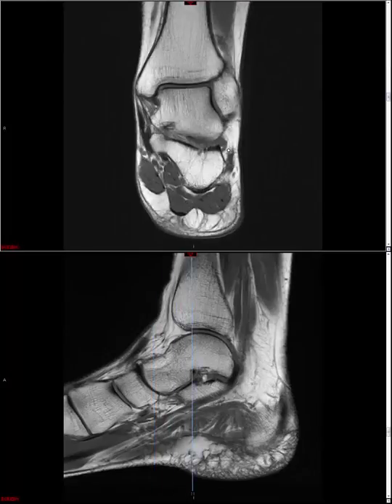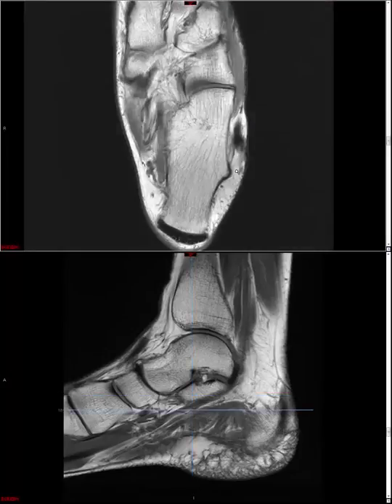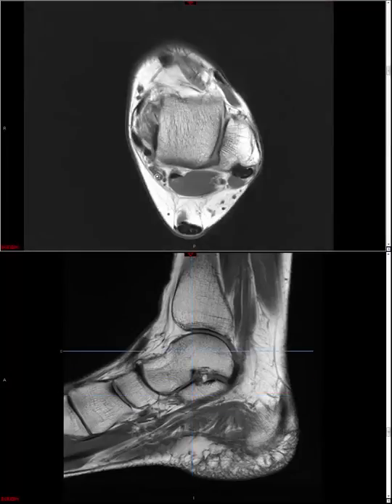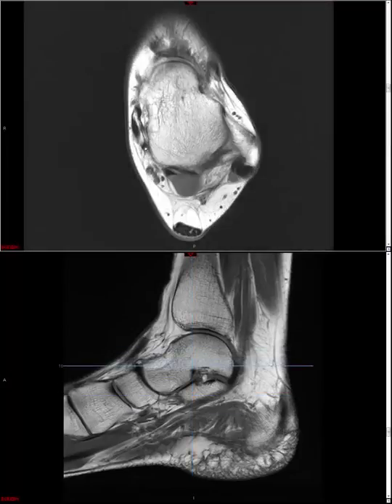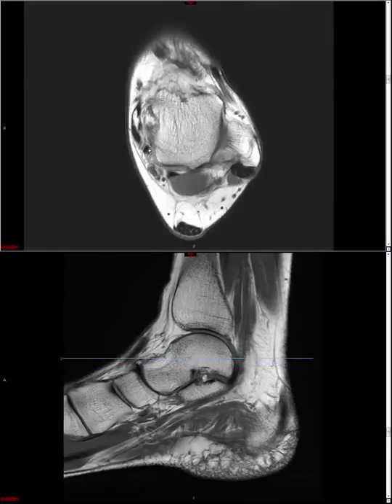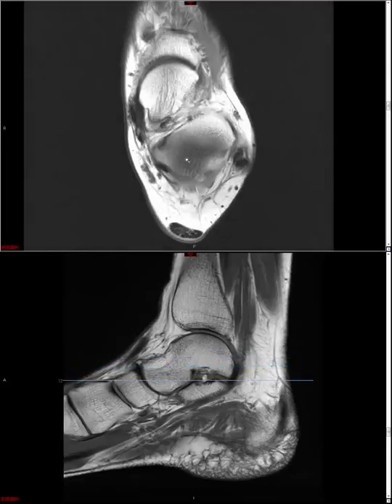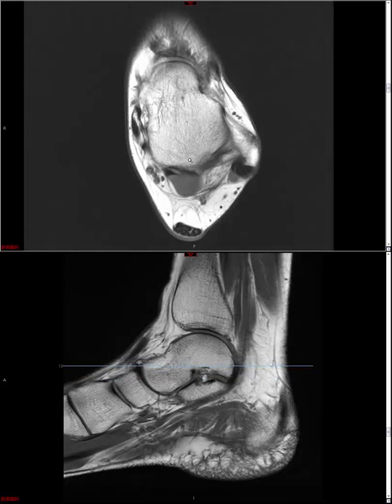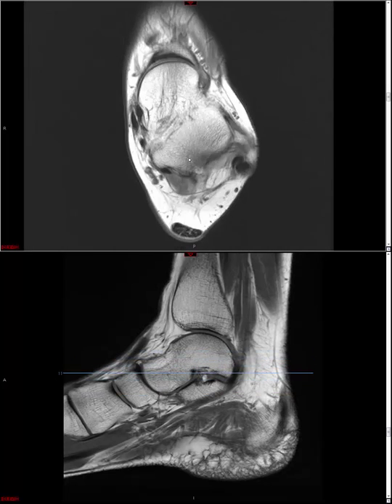On a more distal image, here is the sustentaculum tali, flexor hallucis longus, flexor digitorum longus, and tibialis posterior. If we see heterogeneous signal, we might query tendinosis. If we see attenuated appearance or high signal within the tendons, we start talking about partial or full thickness tears.